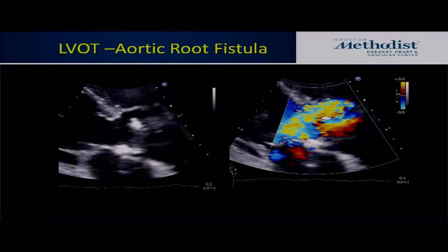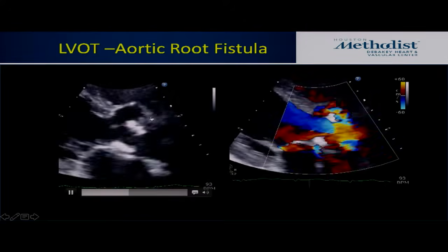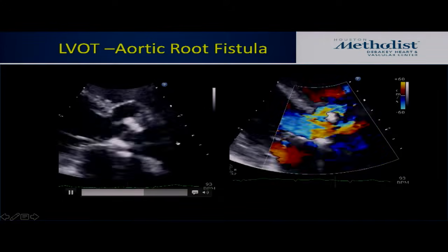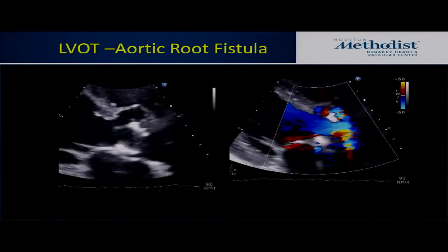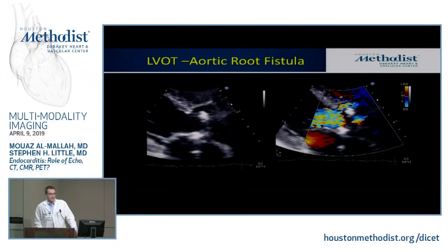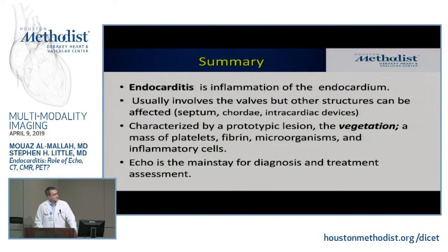Then, okay, so now we have a true aneurysm, or sorry, a fistula. So now it bursts at both ends. It's coming up from above here in the aorta, coming right around, and look how much less pulsatility there is. So the pulsatility disappears when you open up both ends. So that's a fistula. By definition, open at both ends, a pathologic communication, and this is what the surgeon finds. So down the aorta and out into a chamber where it shouldn't belong.